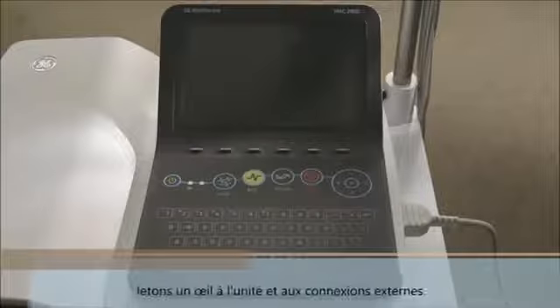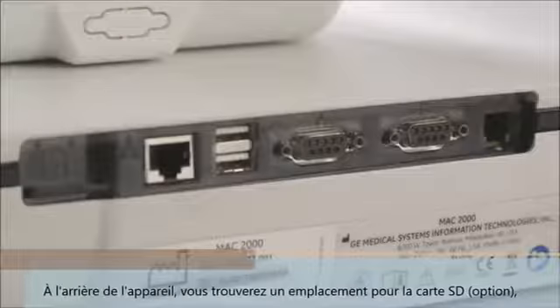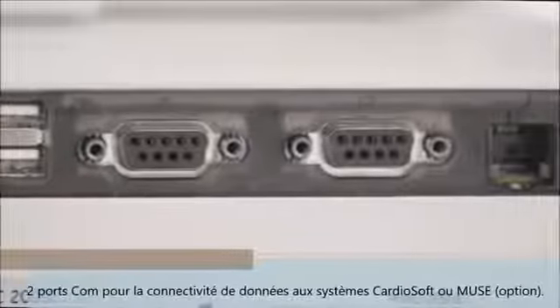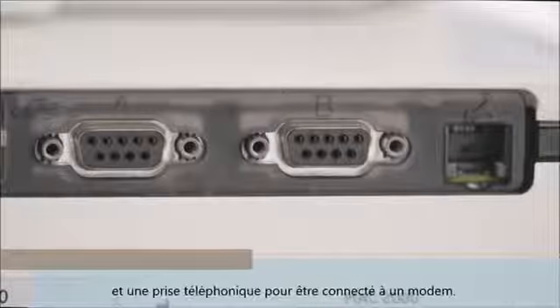Let's take a quick look at the unit and the external connections. The patient cable is connected to the port on the right side of the unit. At the back of the unit, you will find an SD card slot, an Ethernet LAN connection, 2 USB ports that can be used for optional barcode reader and Wi-Fi, 2 COM ports for data connectivity to CS or Muse systems, and a phone jack that is for an analog phone line that connects to the internal modem.